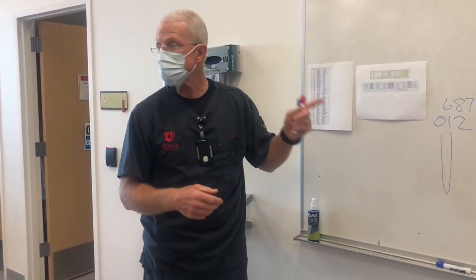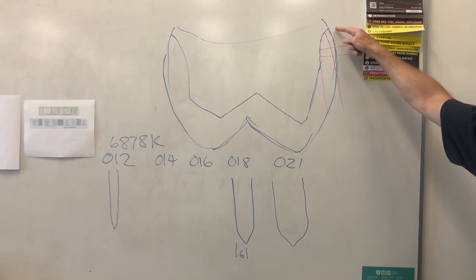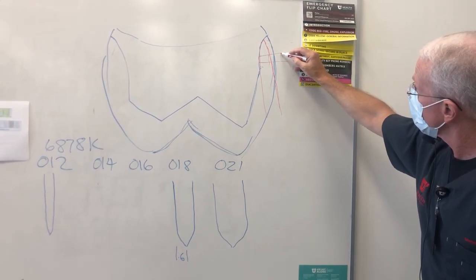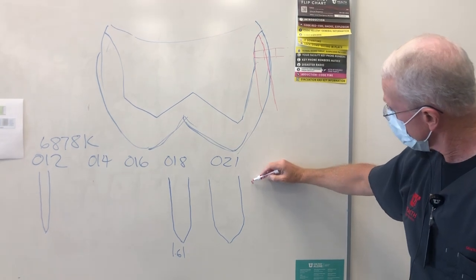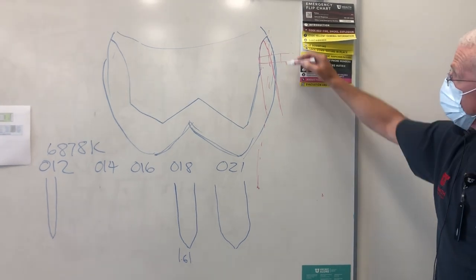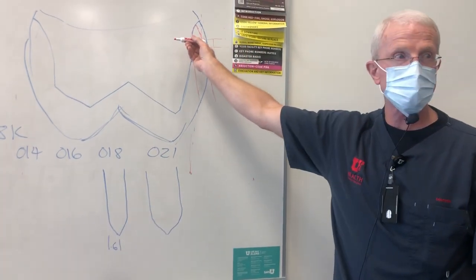But the other thing that is difficult, and that's why we don't precisely measure this, is, okay, let's say we decided to put a probe in. We got off the slope and we came up onto the axial wall. Well, if you happen to look down on your probe, let's say here's a millimeter, here's 2 millimeters, if the observer's eyes were about right here, that would look like about a 1 millimeter chamfer, wouldn't it? But if the observer was over here, it would look like it was about a 1.5 or 2 millimeter chamfer. And so just where you are when you're looking down the axis of the preparation and trying to measure that makes a difference as well.